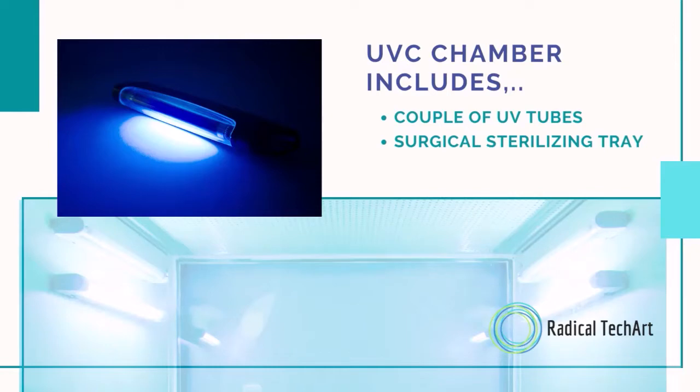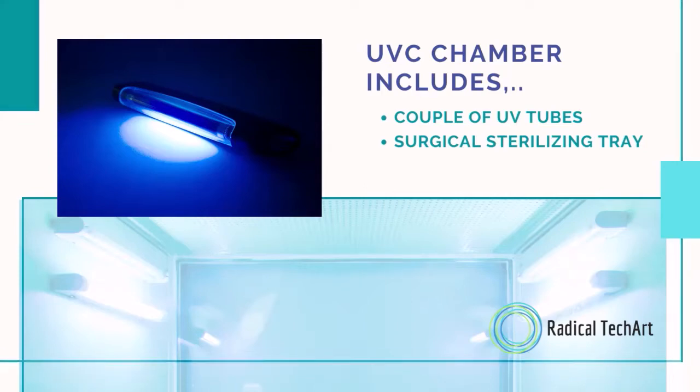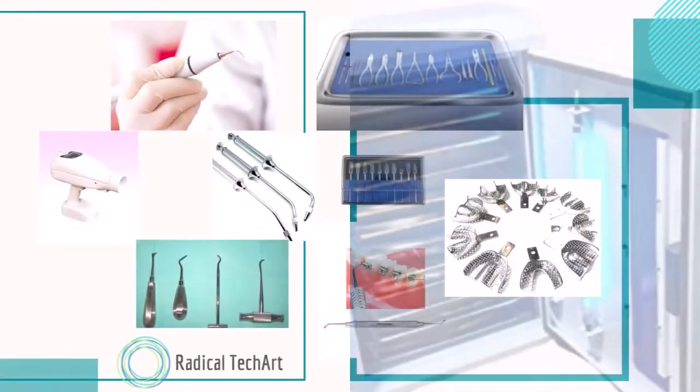The UVC chamber includes a couple of UV tubes and a surgical sterilizing tray, as well as an indicator light while it is in operating mode, along with a timer. Now you can see the real video with our instruments.